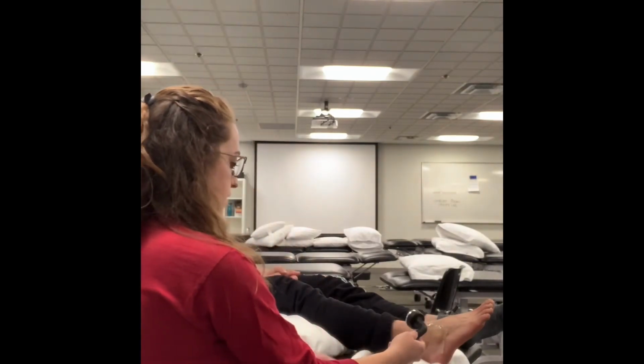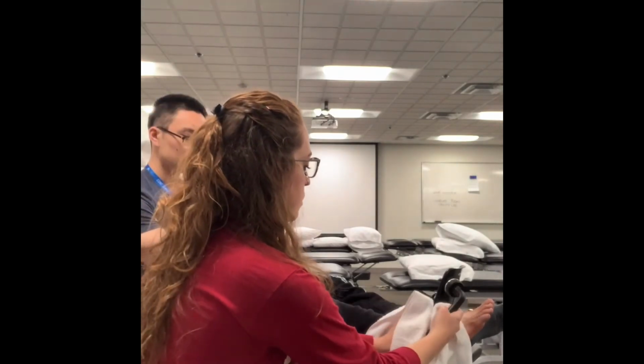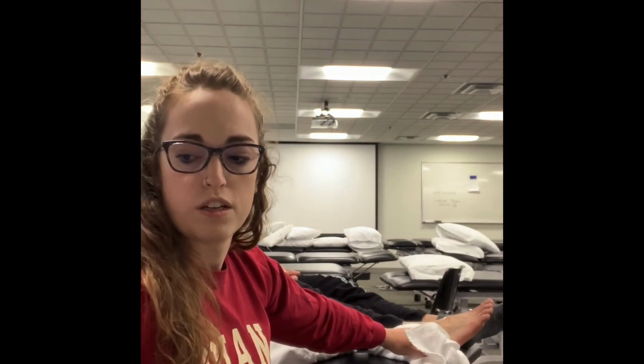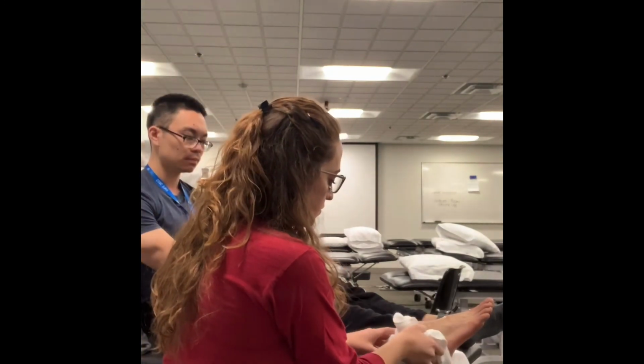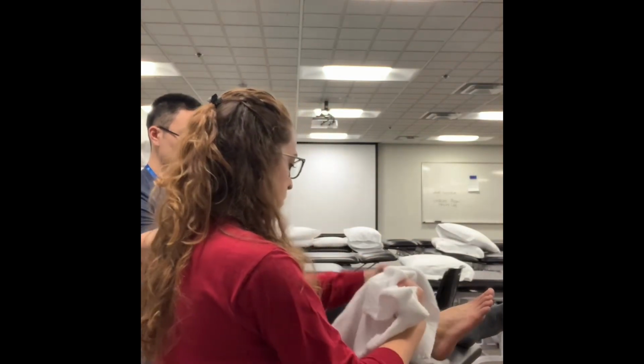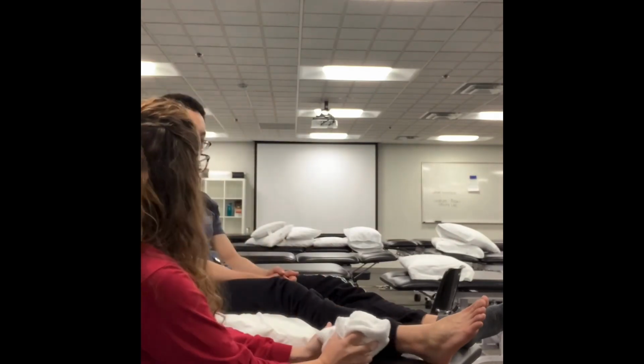Okay. How'd that feel? Pretty good. Pretty good? Okay, I'm going to wipe all this off now. Okay. So now we can get started with the rest of our treatment, okay? Okay.